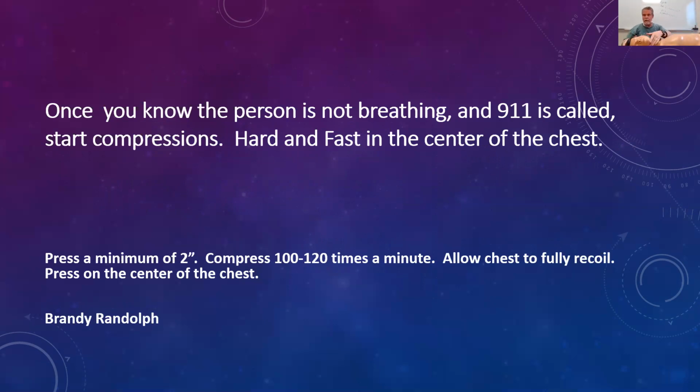The assessment for the patient, and I have one here that can hang out in front of us. As you approach that patient, imagine someone's down, they're not tracking you, they're not watching you as you come up. Well, after I ensure that my scene is safe, I say, hey man, are you okay? Are you okay? And if they're unresponsive or they don't respond appropriately, I'm going to tell someone, or potentially I can just take my phone and call 911.